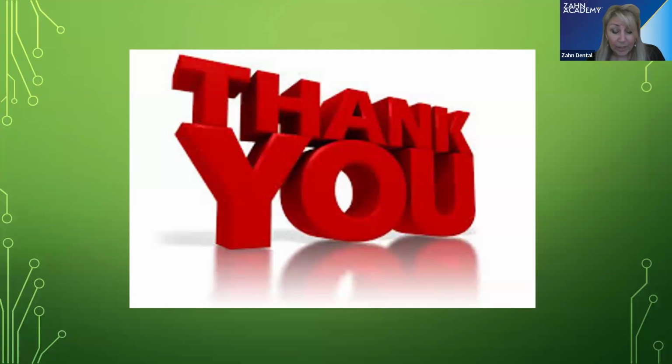Sure. We had quite a few people decide to answer for us, so I want to thank everybody for getting involved, because it means a lot. For the first question, are they currently fabricating surgical guides, 40% are saying yes, and 60% are saying no. So do you have any comment on that, Dan? I'm happy to see that 40% are doing it. I'd like to see more, and hopefully that'll be the case.